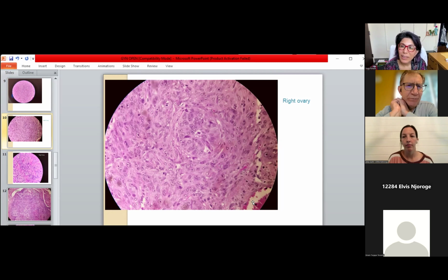It has a mixture of glandular and solid morphologies. I was a little worried. I saw a bit of what I wondered if it was pigment or something. So I think I would even include melanoma in the differential, as it always can mimic those sorts of things in an odd way.